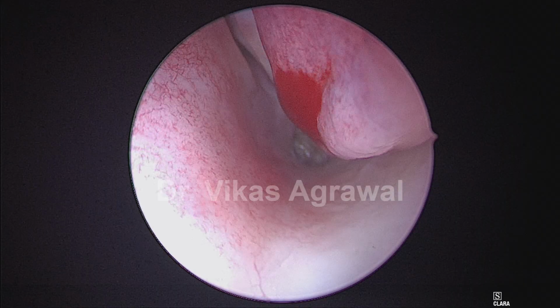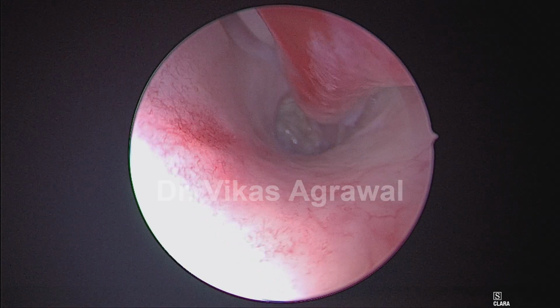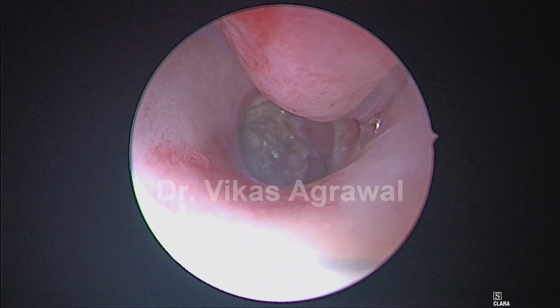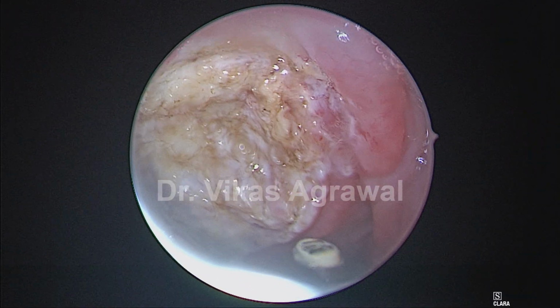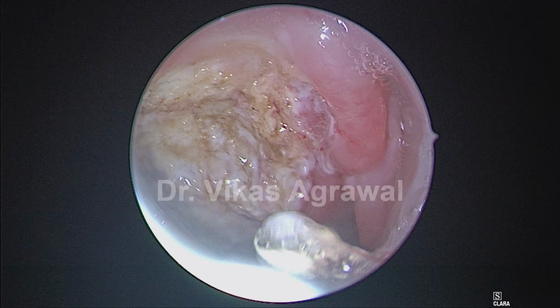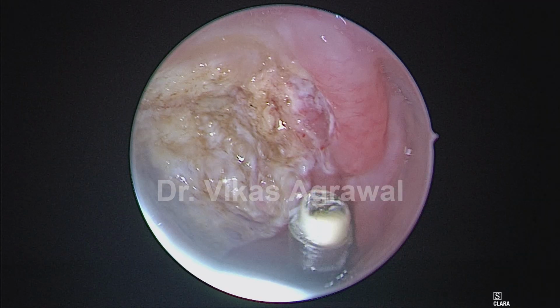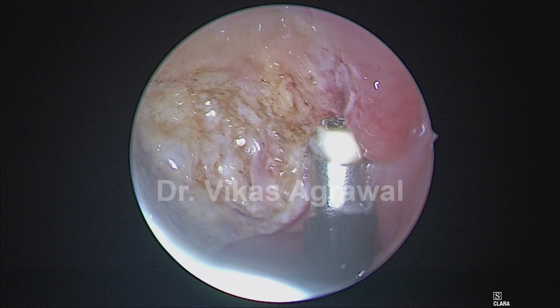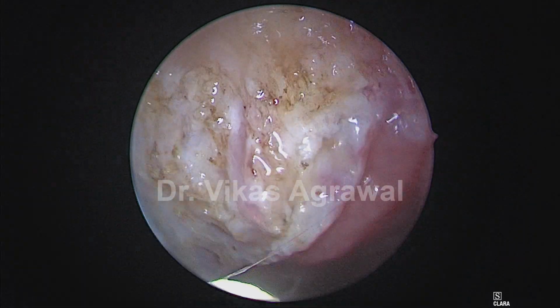So obviously, you should prevent any trauma to the turbinates while decongesting. Now you see, a lot of work is pending here, right? This is the torus tuberous. This is the adenoid tissue. This all is adenoid tissue. So I have to do a lot of work. Can you put some saline?